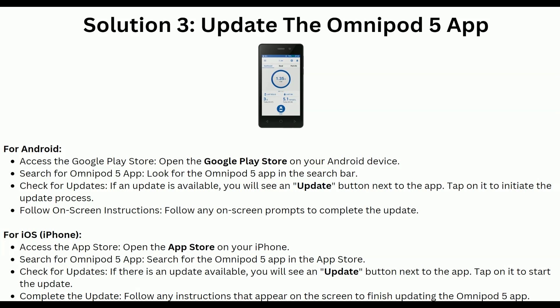For iOS users, open the App Store on your iPhone and search for the Omnipod 5 app. Check for updates — you will see an update button next to the app. Tap on it to start the update and follow the instructions that appear on the screen to finish updating the Omnipod 5 app.